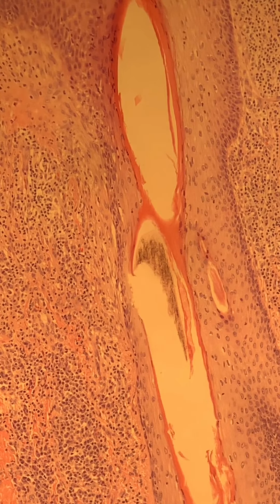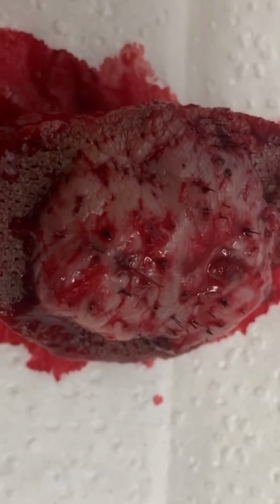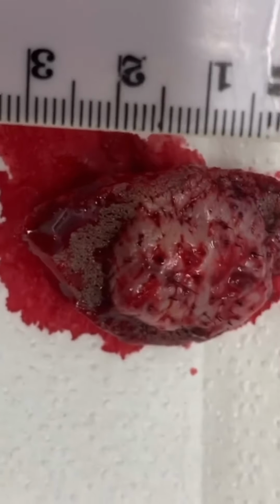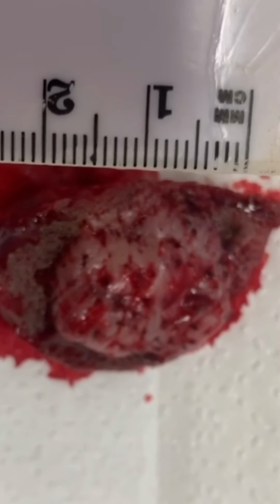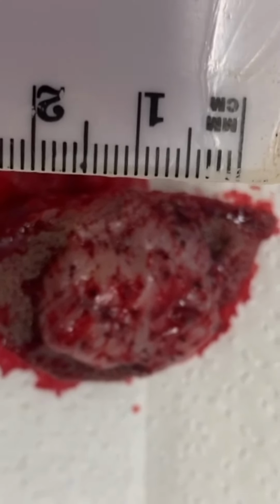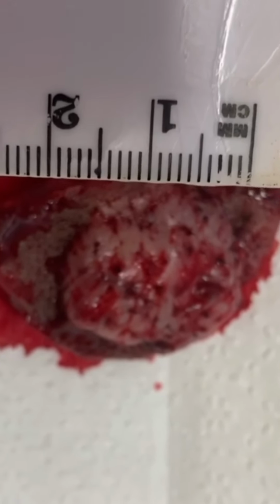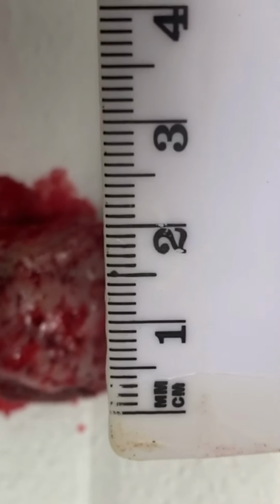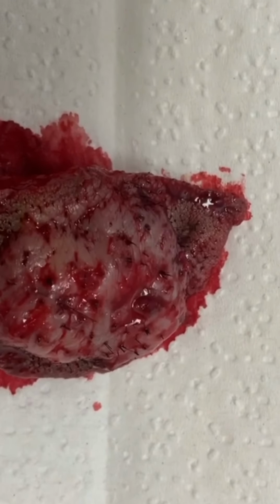So all in all, the sample has been removed, and as you can see, you're looking at the tumor here, which is a surface skin tumor, probably a keloidal sort of reaction. But anyway, it measures right at 2 by 2 centimeters in maximum diameter.